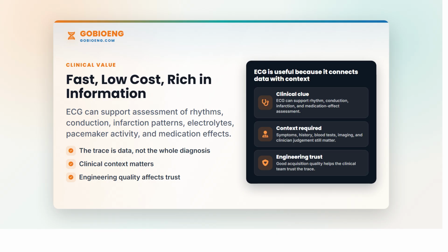The instrumentation amplifier boosts small differential signals while rejecting common mode noise. High common mode rejection is central to clean ECG acquisition. Filters reduce baseline wander, muscle noise, and mains interference. But over-filtering can distort clinically important waveform features. Isolation and protection circuits help keep the patient safe. The analog to digital converter turns the analog signal into digital data for display, storage, printing, and algorithmic analysis.